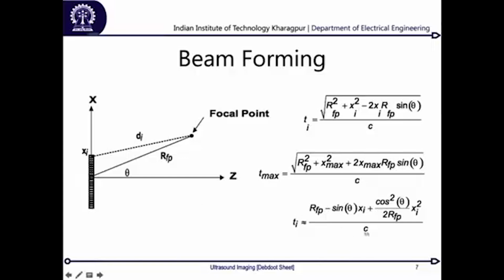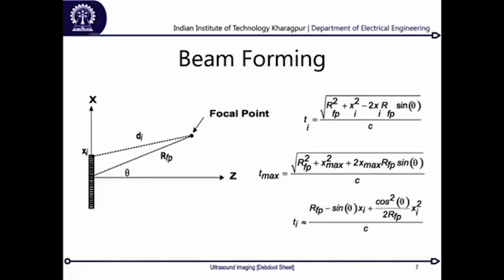Together, if we look at this whole concept and even reduce it in terms of this theta, it makes the job easier, because now you do not need to know this di and this x and everything; you just say what is the radial distance between the point I am trying to look at from my transducer centroid and at what angle it is located. So now you have a way in which you can do a sweep in the angular direction and find different points located along that sweeping array. Okay, this is the way in which imaging is carried out.